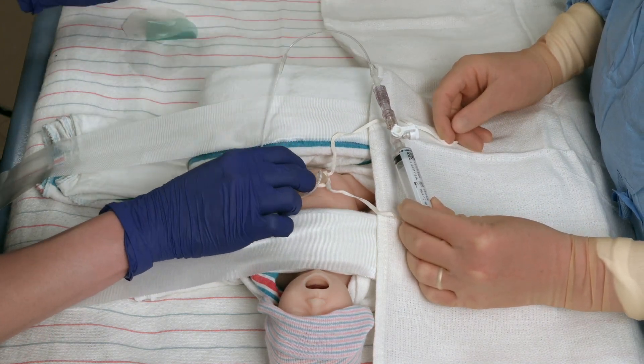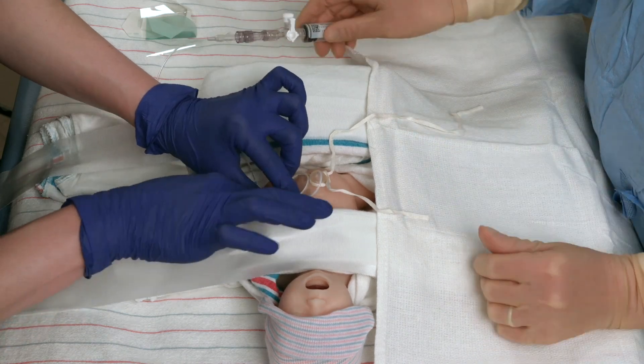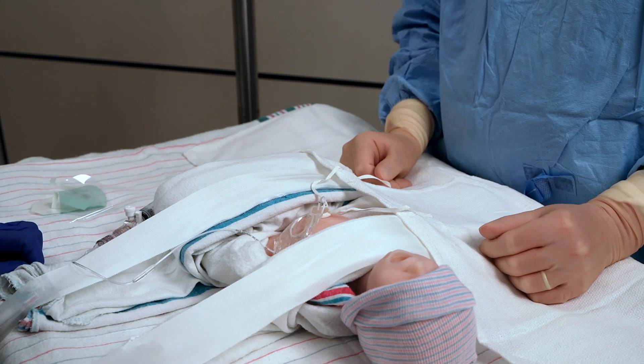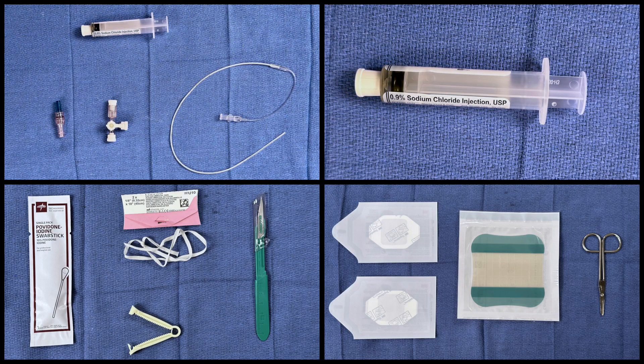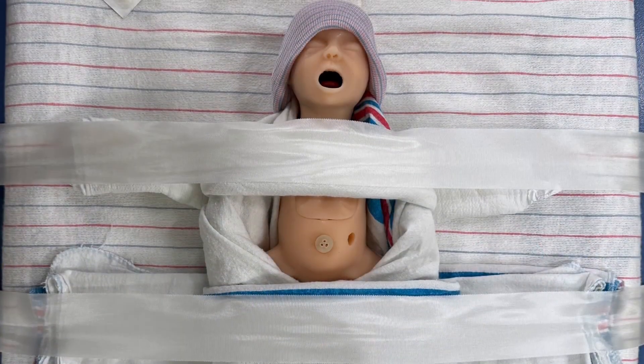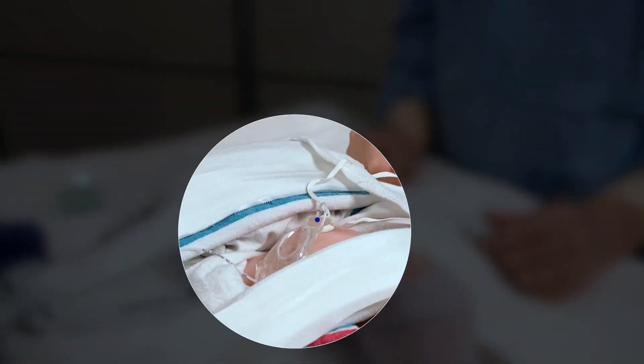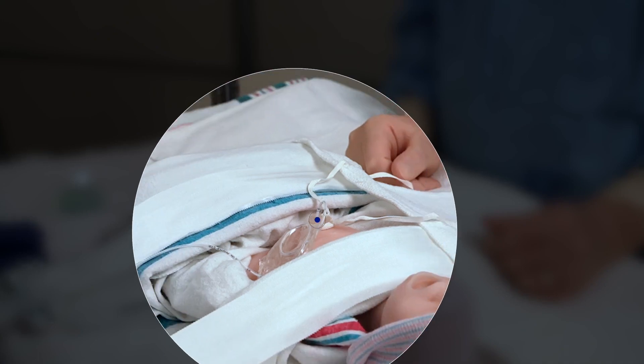Maintain an airtight system to prevent air bubbles from infusing into the baby. When giving medications or flushing, attach the syringe to the available stopcock port. Turn the stopcock so it is open between the syringe and the catheter. Assess the color of the infant's extremities, check pulses, and note the centimeter marking at the umbilical stump and secure the umbilical line to the infant's abdomen.